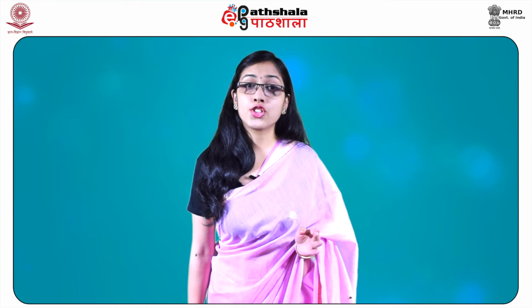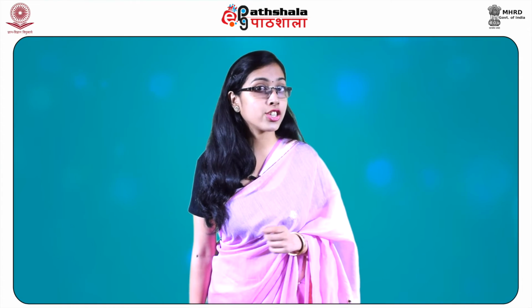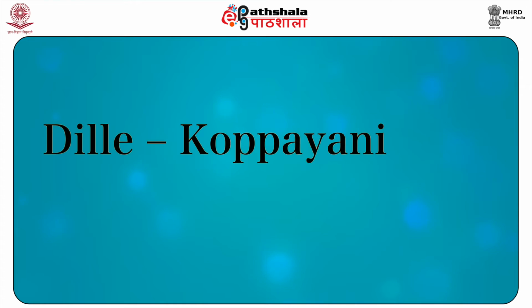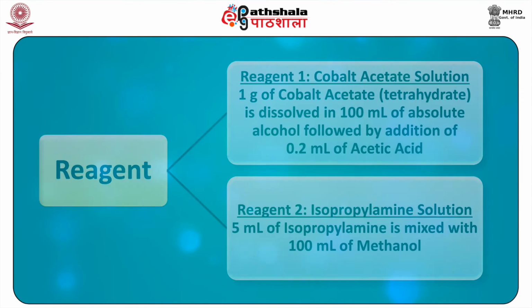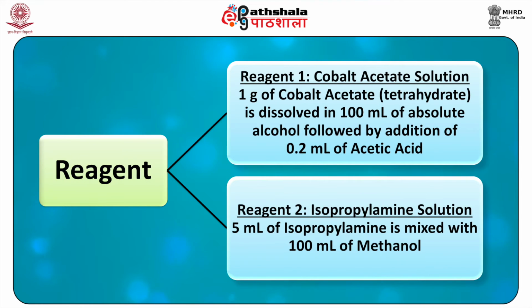This green color changes to light green on the addition of acetic acid. Next is Dille-Koppanyi test. For the preparation of reagent, let us take reagent 1, that is the cobalt acetate solution. In the solution, 1 gram of cobalt acetate, that is tetrahydrate, is dissolved in 100 ml of absolute alcohol, followed by the addition of 0.2 milliliters of acetic acid.